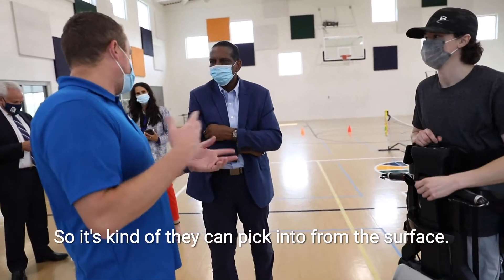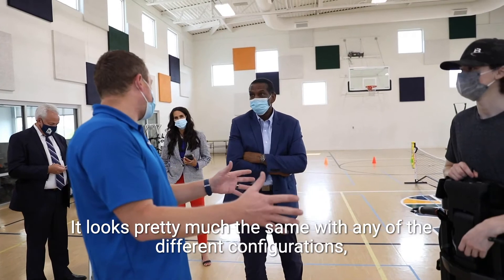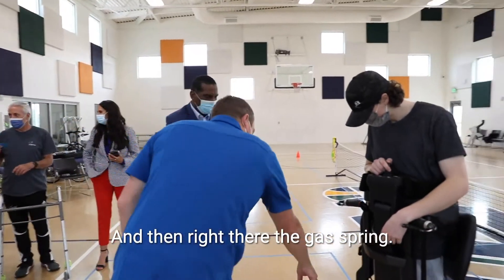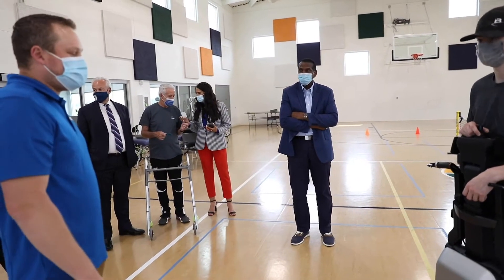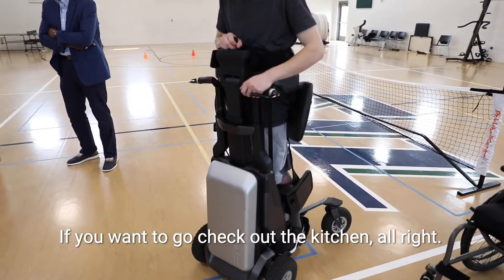Is there electric on the indoor also, or just the outdoor? Yeah, they can pick and choose. From the surface it looks pretty much the same with any of the different configurations, but the difference would be the wheels and the springs versus electric — not really noticeable to most folks when they're in it.